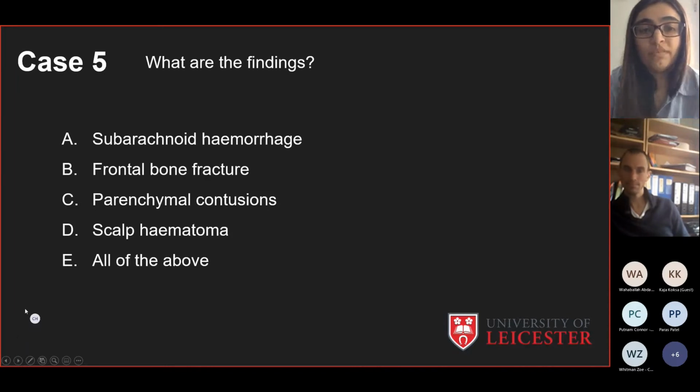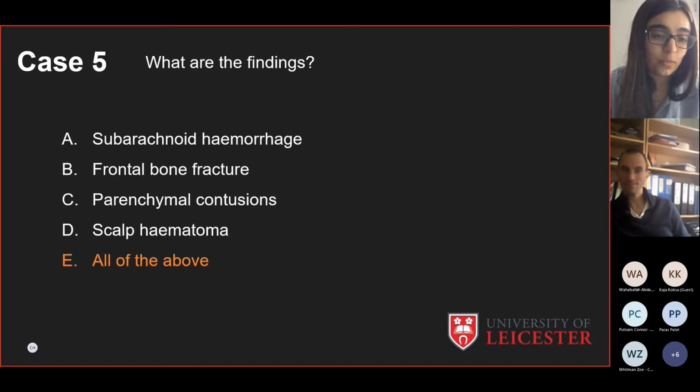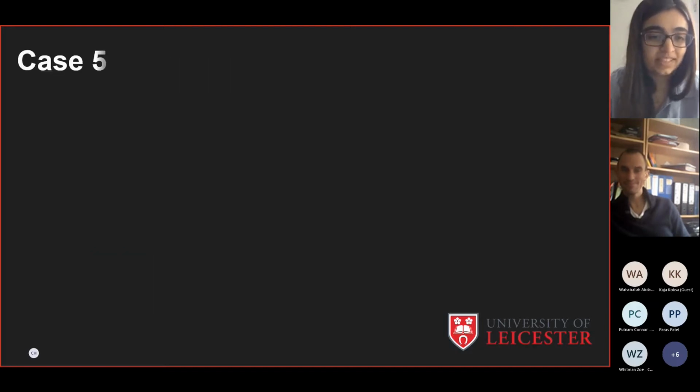Okay, what findings were on the images? I'll bring them back on for you, and then you can talk me through what you're seeing.